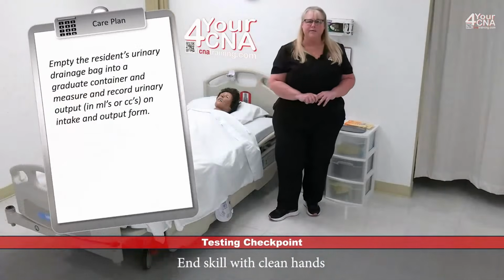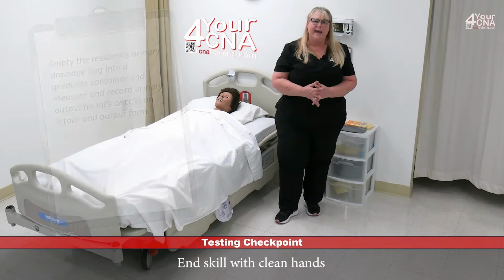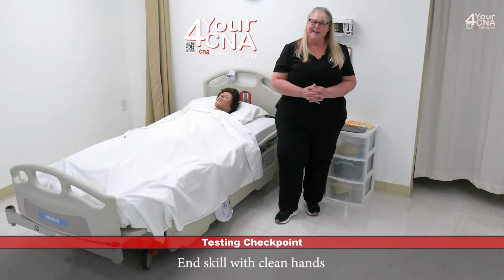After washing my hands a final time, I'll review the care plan, make any corrections, and then tell the evaluator my skill is done.